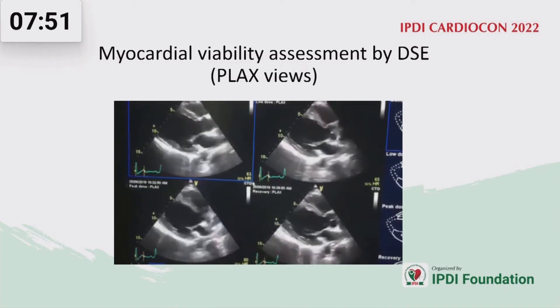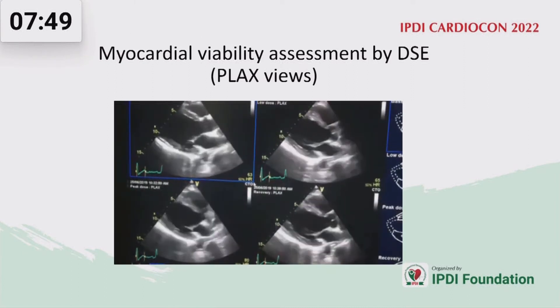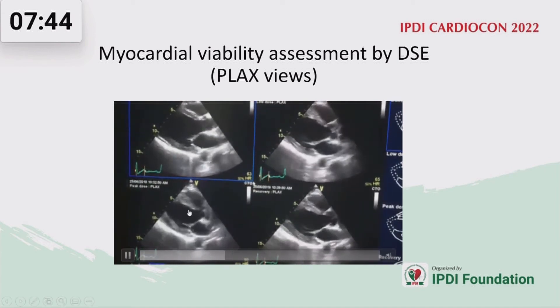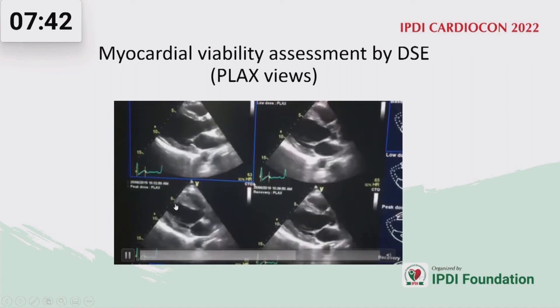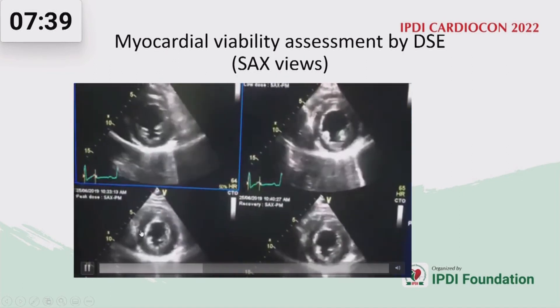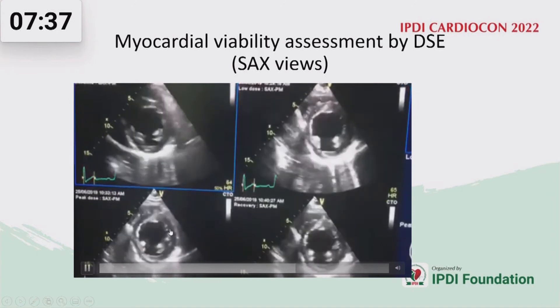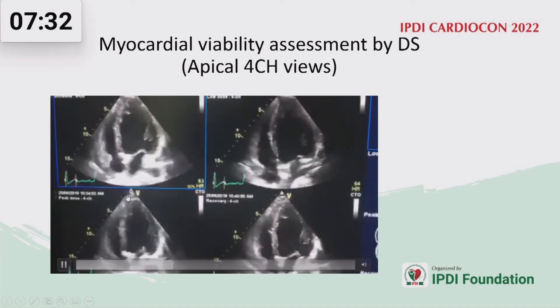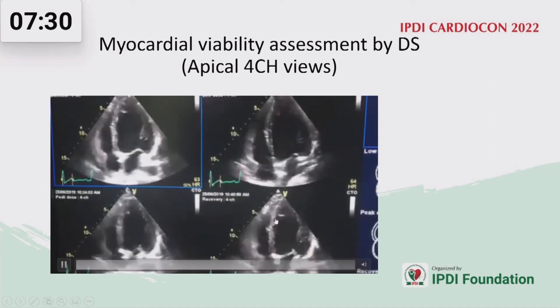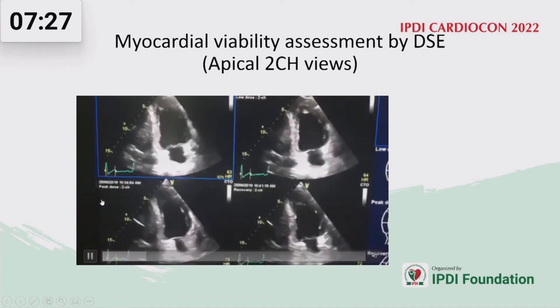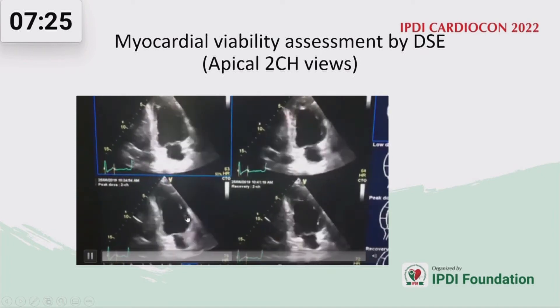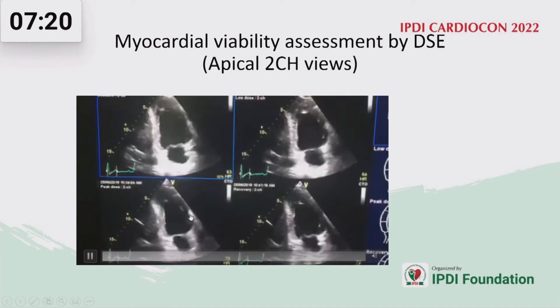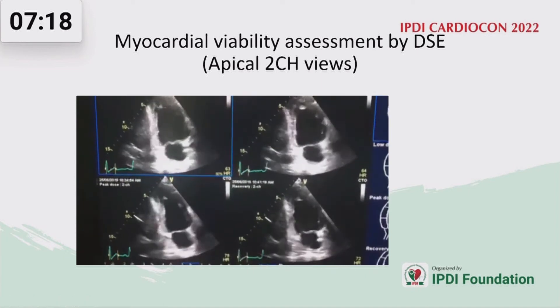Dobutamine echocardiography is used to detect contractile reserve. In the parasternal long-axis view, the septum and anteroseptum improved after dobutamine infusion. Short-axis view showed improved contractility of the septum, anteroseptum, and anterior wall in the mid region. Apical four-chamber view showed improved contractility of the basal and mid septum. Apical two-chamber view also showed improved contractility of the basal and mid septum after dobutamine infusion, confirming myocardial viability by contractile reserve.